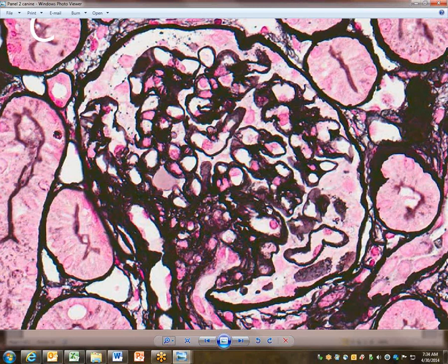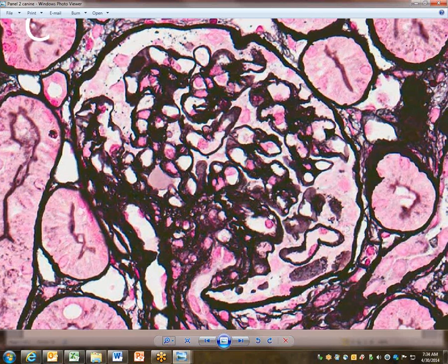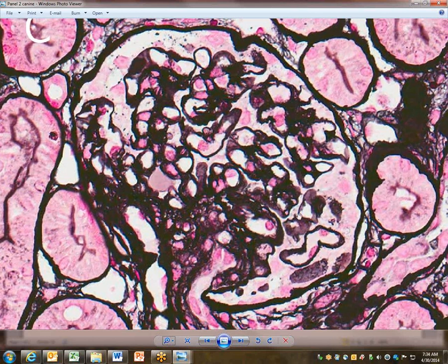The fact that we look at it in the H&E and begin to spout off about where things are is sort of reading between the lines, as opposed to actually being able to see it clearly. Rachel, would you mind helping to delineate how you would know that that's mesangial expansion versus sclerosis?